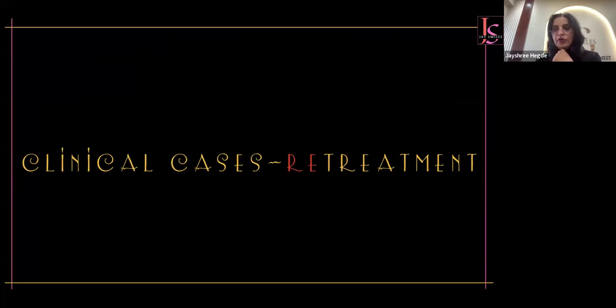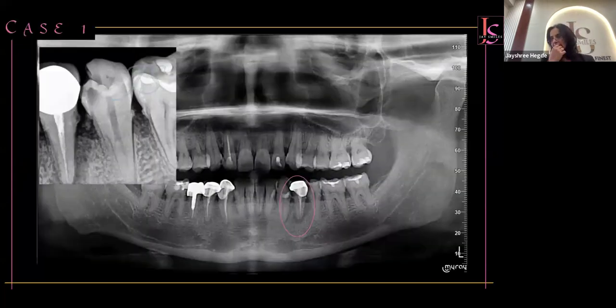So before we wind up, I would like to wind up with just 5 cases of mine. And mine is more of a retreatment center than a regular practice. I get more failed cases. So this is the case which I showed you. I don't have a very good pre-op, but you can appreciate that there is a lot of bone loss in the periodontal area. As I told you, it's a grade 2.